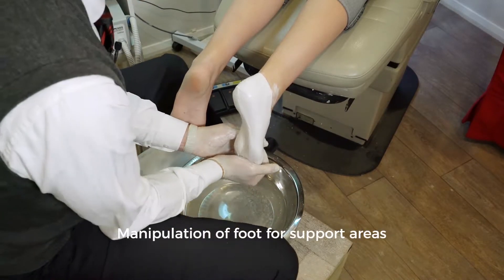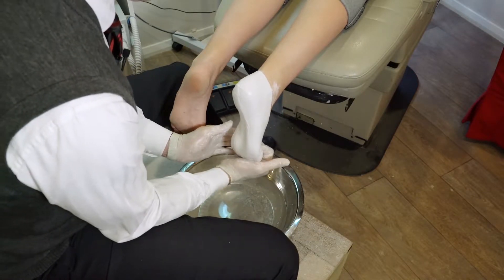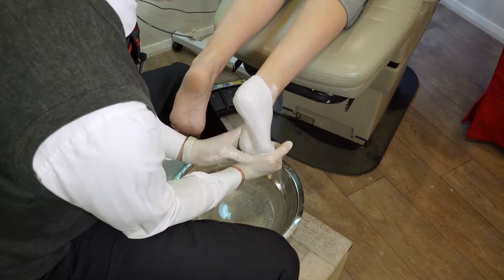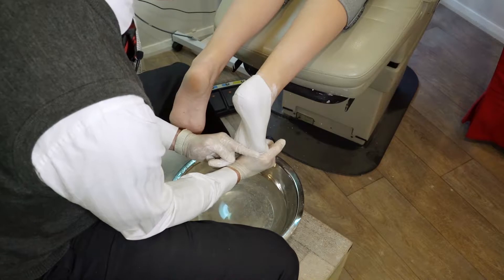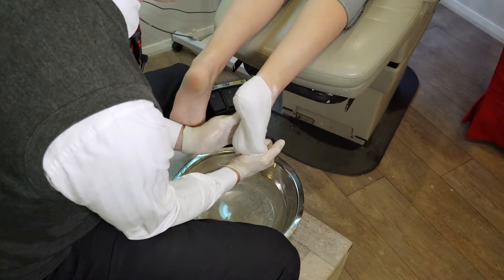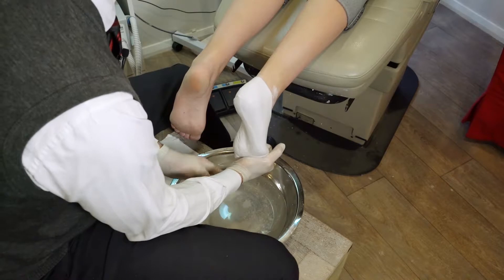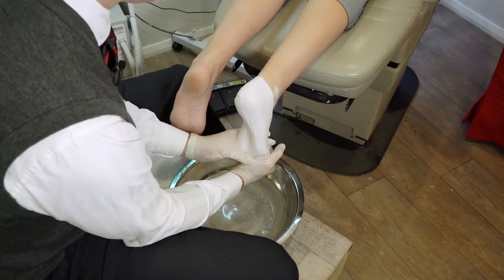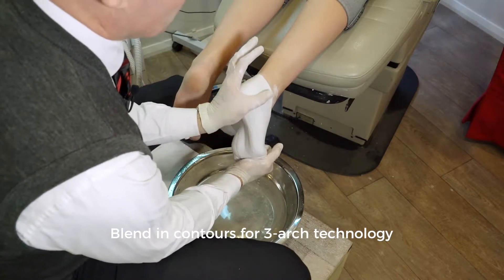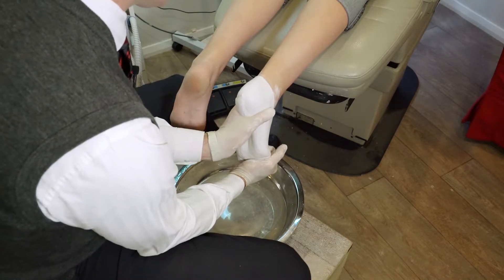Manipulation of the foot involves dorsiflexing or extending the big toe, then plantar flexing it, and dorsiflexing the fifth metatarsal, which basically means the forefoot should be perpendicular to the rear foot mark. That means the foot is now in a locked, rigid, propulsive position. From here we start blending in contours, and those contours reflect the three arch technology that we use at Complete Feet.